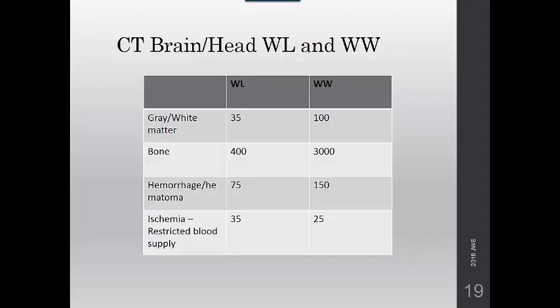A reference angle. We want to use as little angle on the gantry as possible, but angle the gantry parallel to the supraorbitomeatal line in the base of the skull. You want to be able, like I said, to have the patient position themselves so that the base of the skull is perpendicular. You don't really have to use an angle. That's the ideal situation, but that's not always the case.